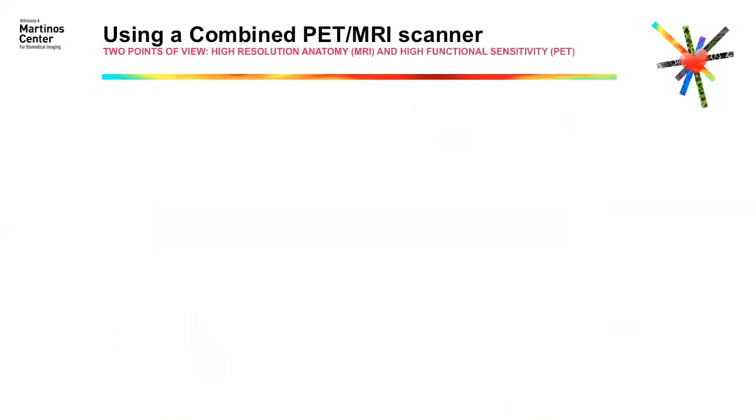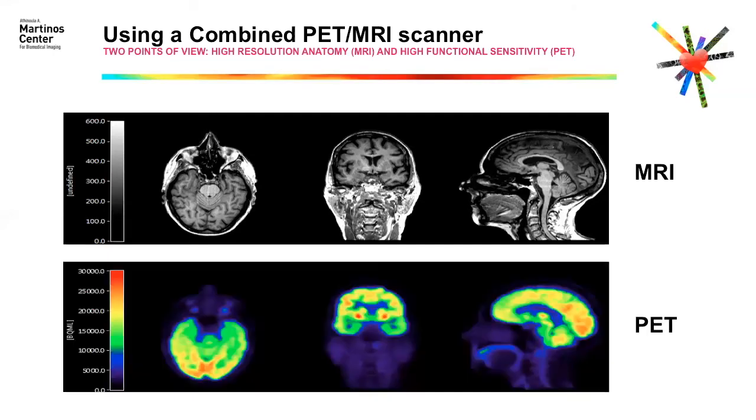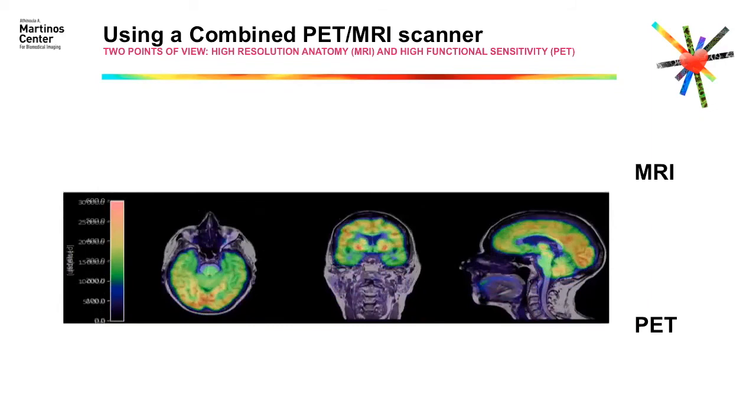So in our case, instead of a PET CT, we are using a PET MR. Well, there's a good reason behind that: MRI is much more versatile than CT. We have many different types of contrasts that we can use in MRI. And MRI, on top of it, can also provide functional imaging techniques using fMRI, which our center pioneered actually 25 years ago. So we can not only combine the MR and the PET and fuse them together to colocalize the signal from the PET on the MR and know exactly in which anatomical part the signal is concentrated.